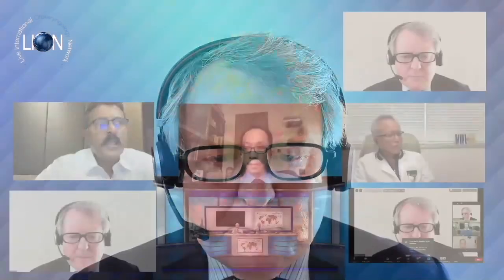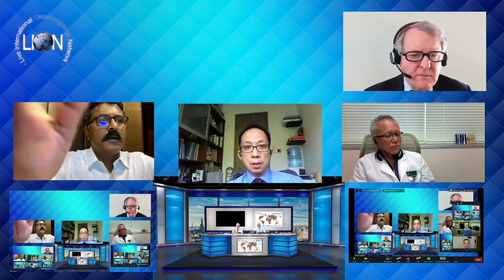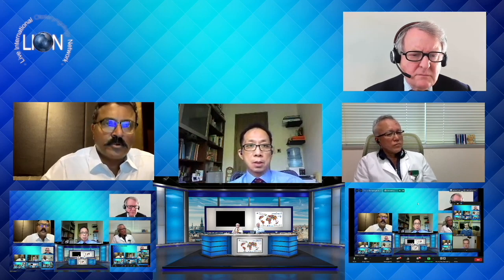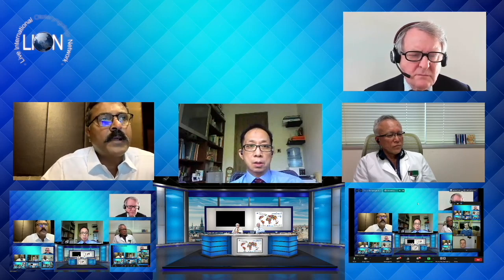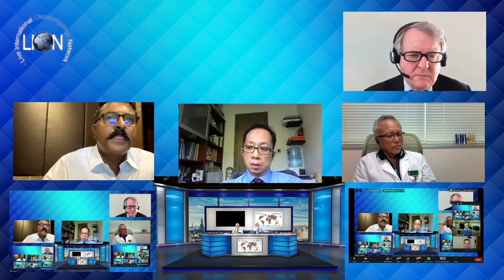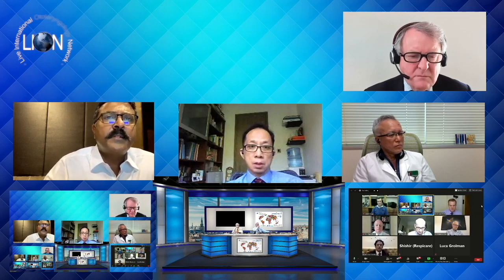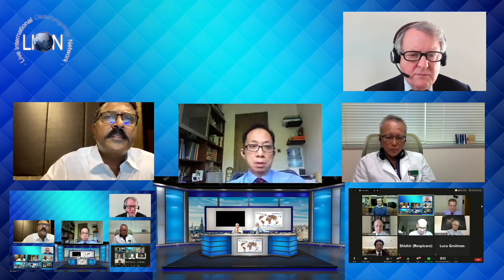And what about you, Ravi? What's the situation in your practice? You switch your microphone on, Ravi. Your microphone's off. Okay now? Yes, we hear you fine. In my practice, it's almost always a transcanal approach. I don't use a speculum holder, but I've learned to use both my hands with the speculum without the holder in place. I don't use a releasing incision except for the very rare, very narrow canal. So 99% is a transcanal approach, and it is mostly under local anesthesia. Everything else remains almost the same.